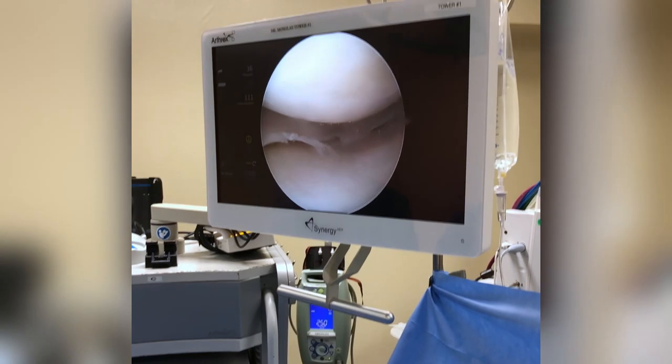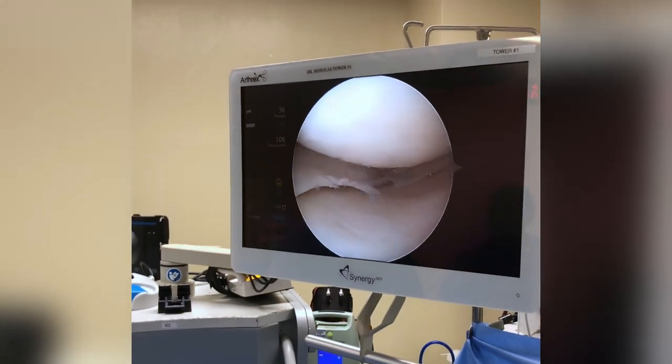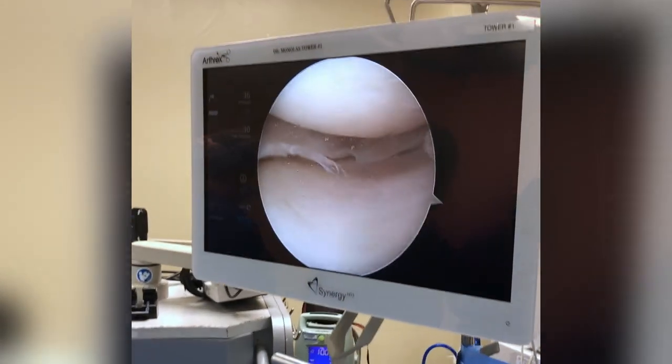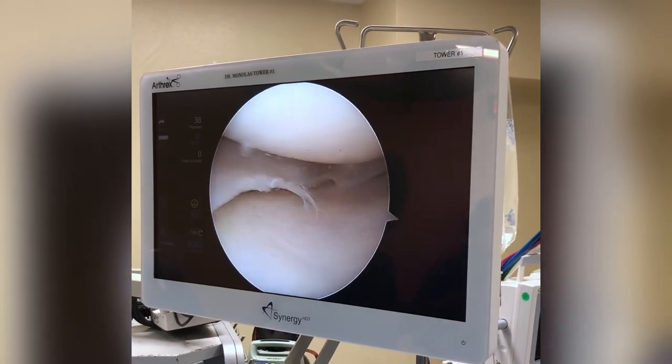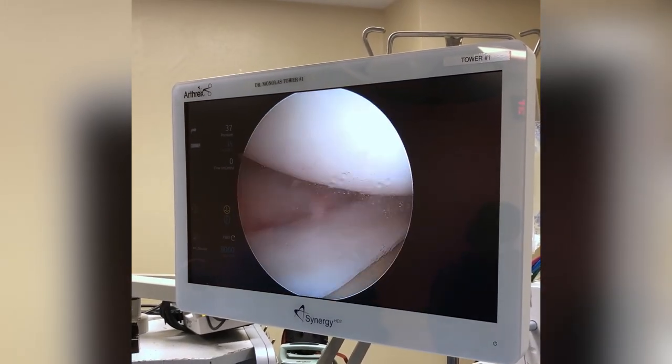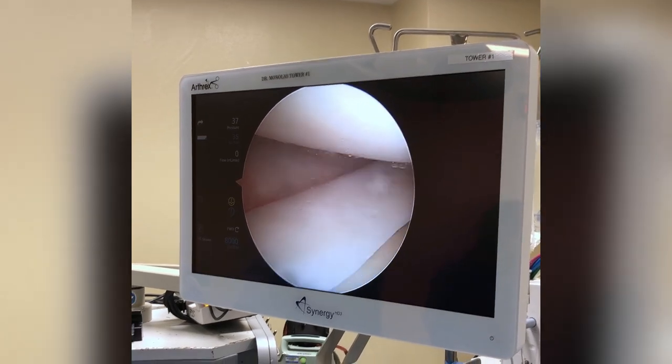Good morning, we're going to do a little surgery on the knee. This gentleman was kind enough to allow us to videotape the meniscus surgery. This is the inside of a patient's left knee. He was running and felt a pop in the knee and some discomfort, and we're about to show you the torn meniscus.